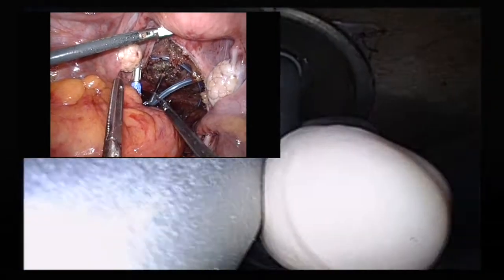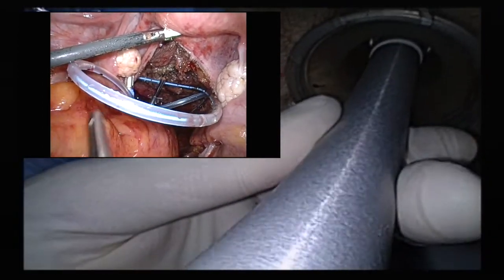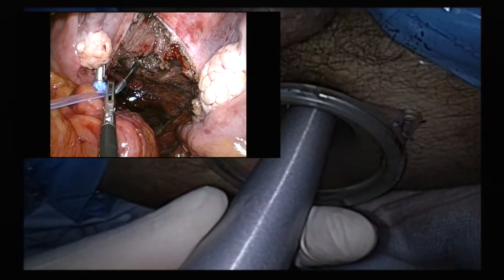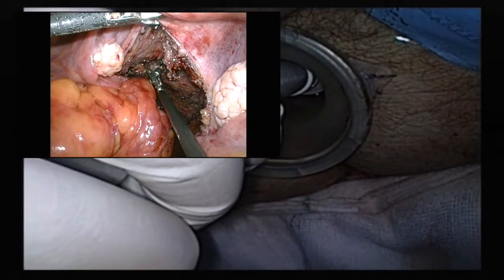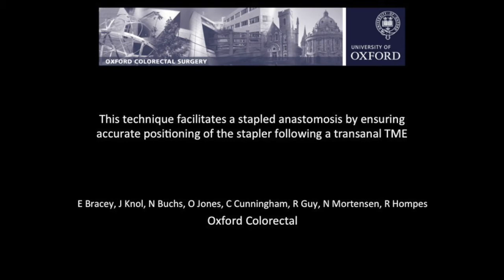From the abdominal side, the laparoscopic operator visualises that the spindle is completely in view before removing the drain from the spindle. The stapled anastomosis is then formed in the usual manner, ensuring that the anal port is removed before the stapler is closed. This technique ensures accurate positioning of the stapler through the purse-string to facilitate a stapled anastomosis in the setting of a transanal total mesorectal excision.